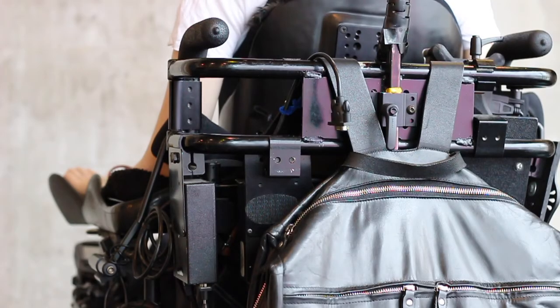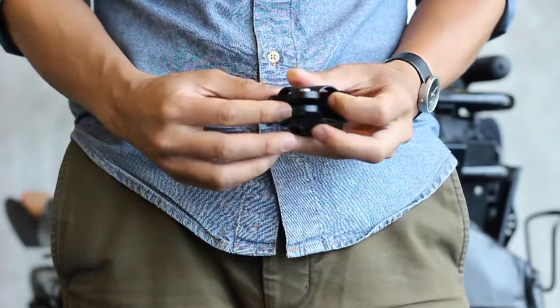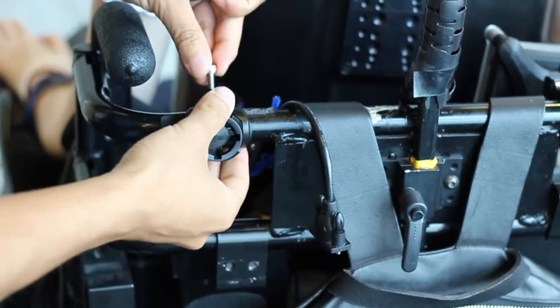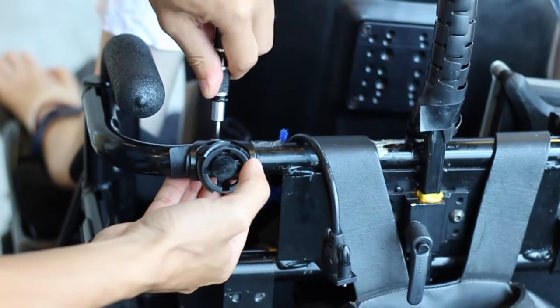To set up your Tekla-E wheelchair mount on your wheelchair, you must first add the padding to the wheelchair clasp. Next, mount the clasp to the back tubing on your wheelchair and, with a hex key, begin tightening the screws to secure it in place.